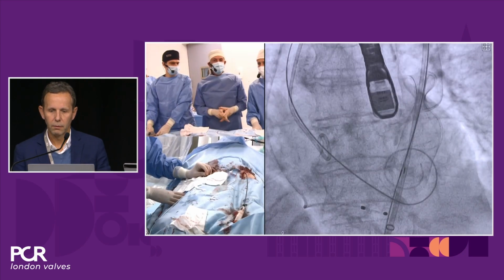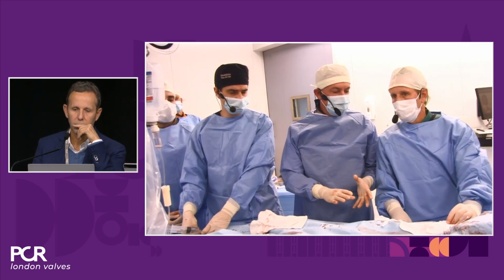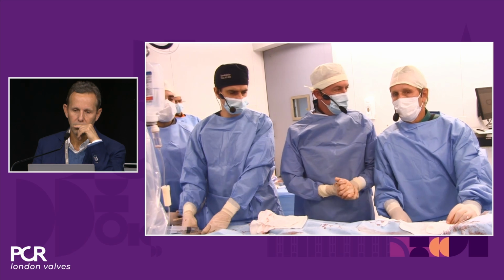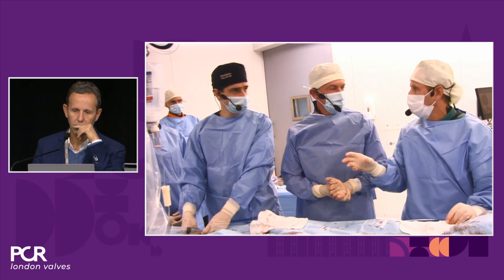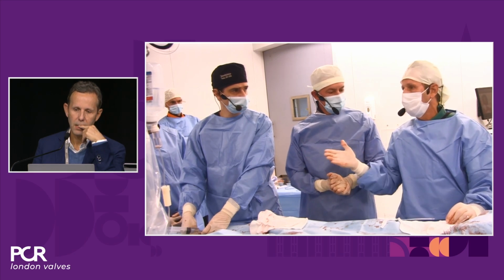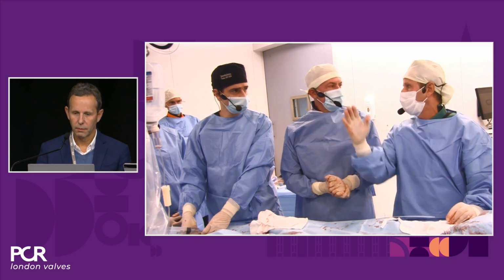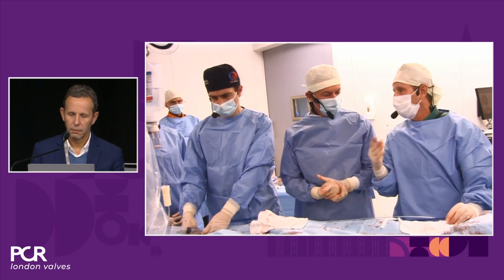I think there'll be no debate in a highly calcified valve like that, we're going to pre-dilate. But for the zero contrast, do you recommend pre-dilatation in all patients? Yeah, it makes it a little bit easier to position the valve, and also in these cases that we are doing with renal failure, almost all these patients had calcium score over 3,000. So they are very calcified valves that we almost always pre-dilate.